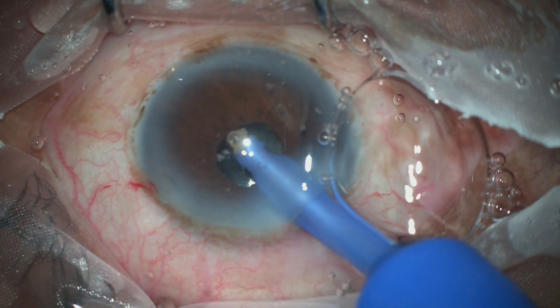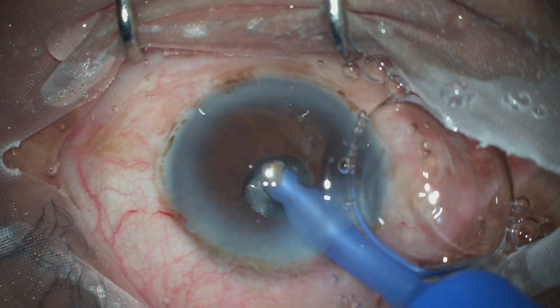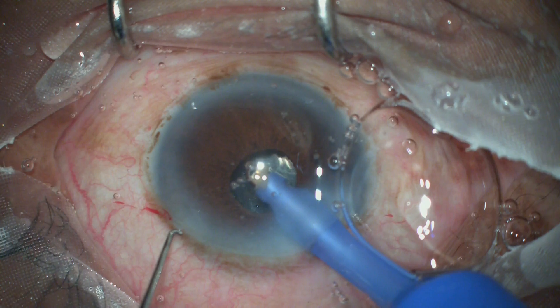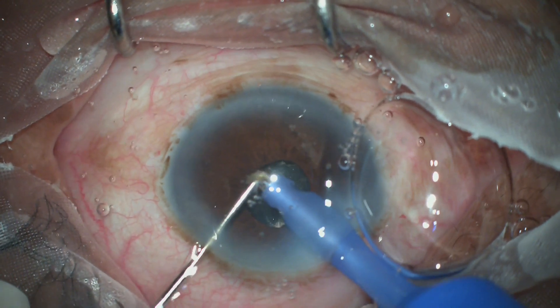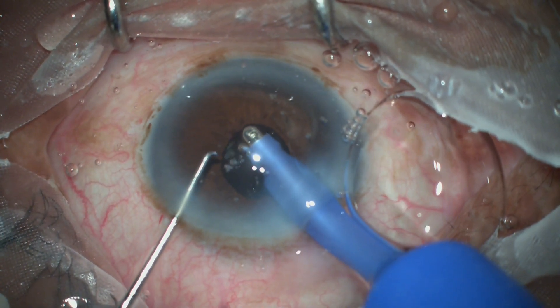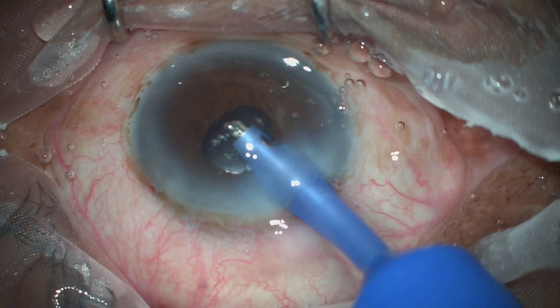However, there is a small hidden piece of nucleus that has come and blocked the irrigation-aspiration port. The best approach is to simply chop and stuff this piece into the aspiration port of the irrigation-aspiration cannula. Though the port is small, these small pieces can be consumed without phaco power if they are stuffed into the aspiration port.